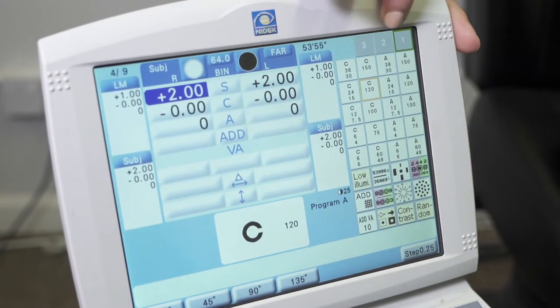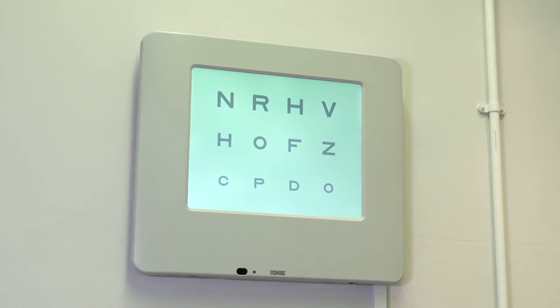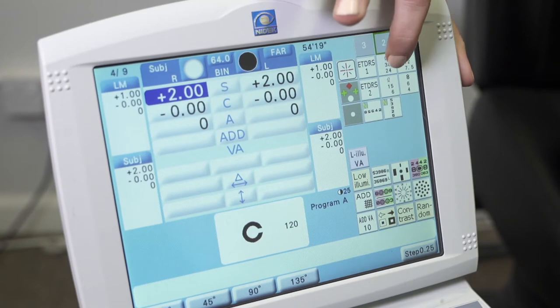There are three pages listing the different chart types available. Page one contains our Snellen visual acuity charts, so we have letters as well as our Landolt C's covering a wide range of sizes from 6/150 all the way down to 6/4. Page two contains our picture testing.